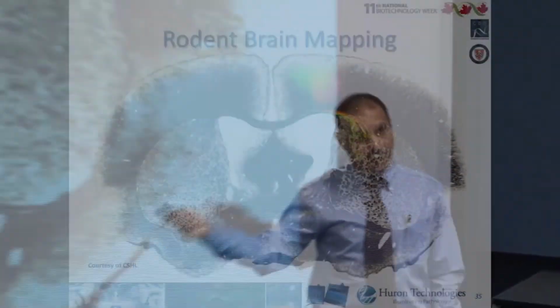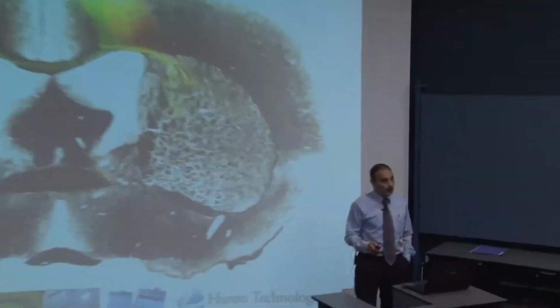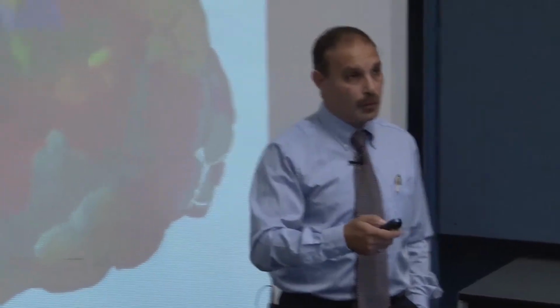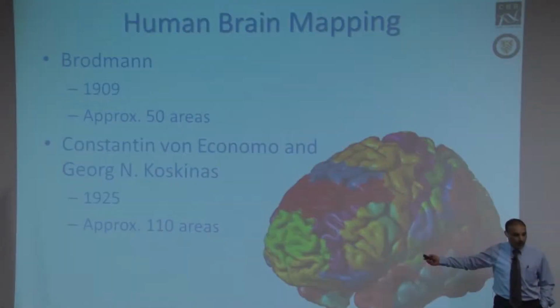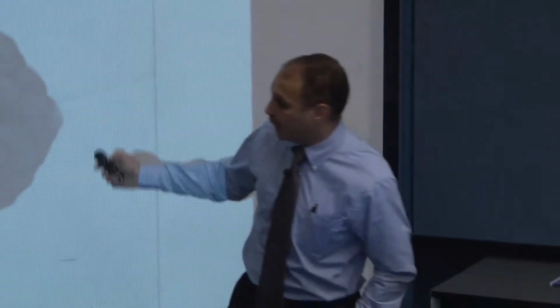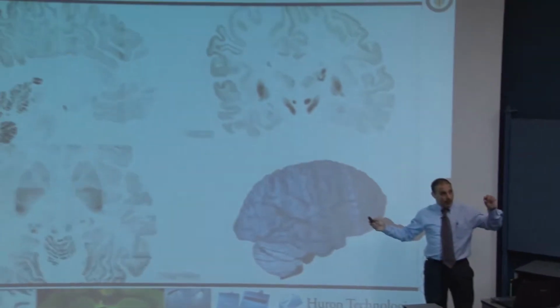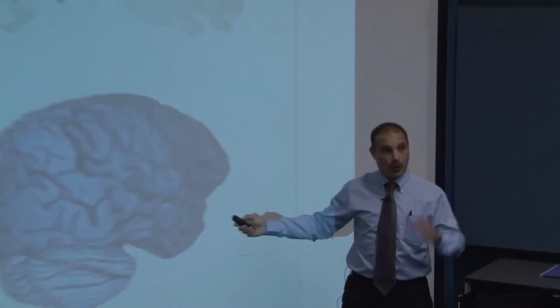You can now combine the bright field and the fluorescence, and then you can, again, superimpose processes that are only possible to see with the combination. And you move now from rodents to human, because now we can actually do that. Instead of the 100-year-old human brain map, we are actually building modern human brain maps that are millions of times more precise. And I'll show you a little bit here. I'll just leave you with a 20 second video here. Instead of 50 micron and 100 micron resolution, we can get to sub-micron resolution now on a whole 3D brain model that you can use now to map.